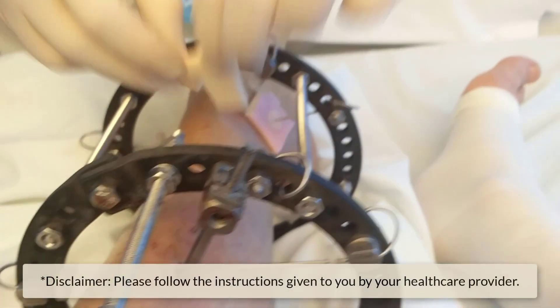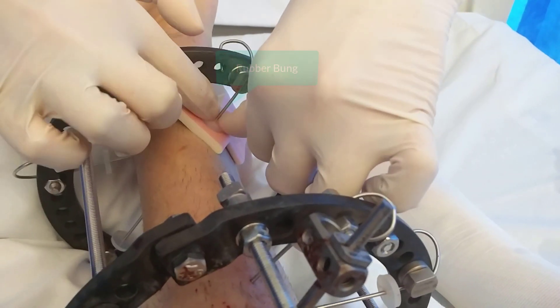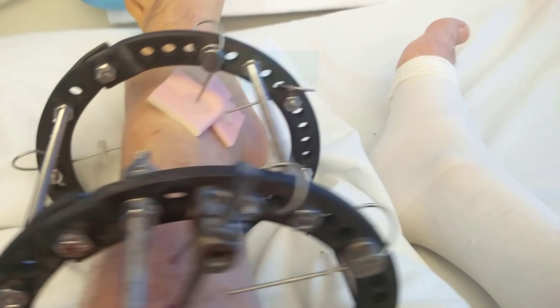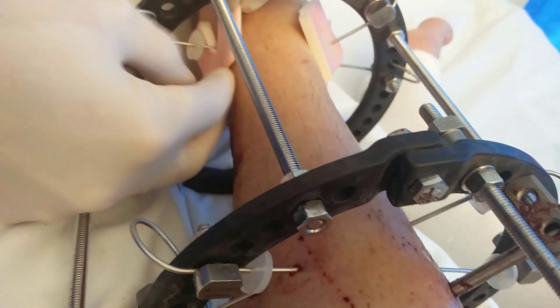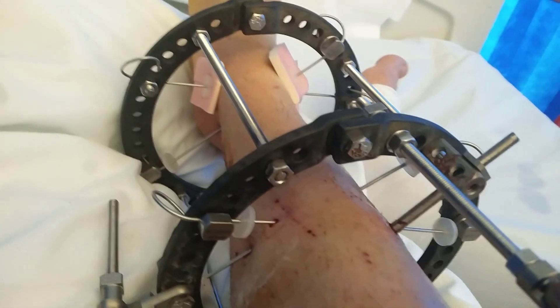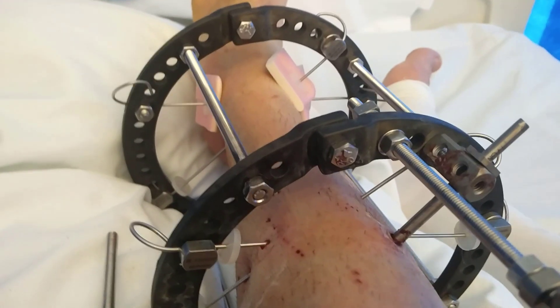The nurse explains: a three-quarter cup just lays over your pin and then you push the button down on top, which keeps your dressings in place without anything sticky touching your skin. That's amazing because if you've got sensitive skin — which I think you have a little bit under this frame — you don't want lots of sticky stuff on you.